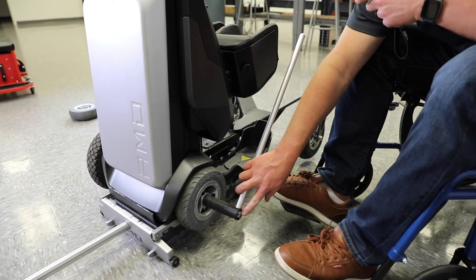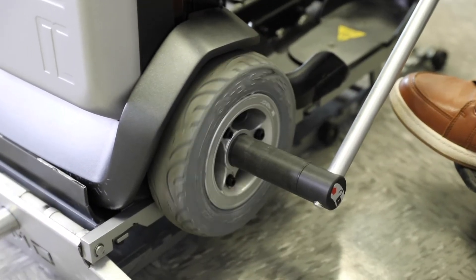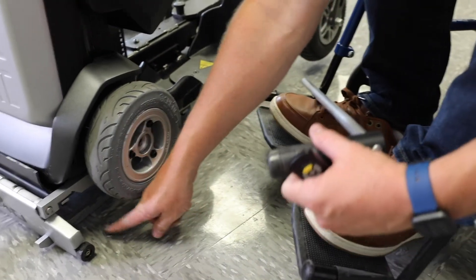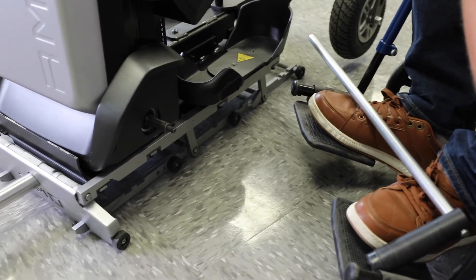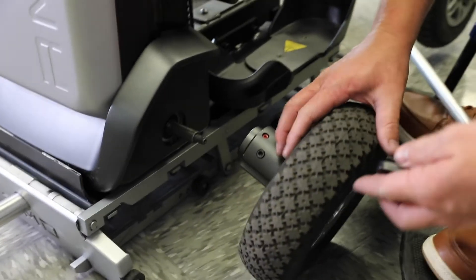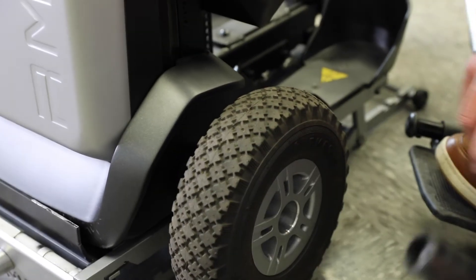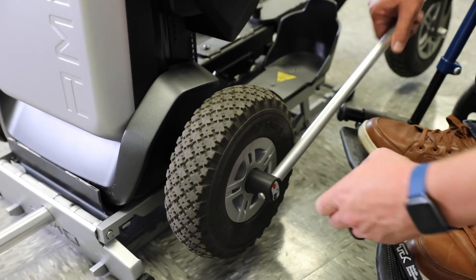Once I've got that on, I'm just going to turn it in the direction to loosen it — so that would be driving it in reverse. I'm just going to pull that bolt out. Now there may be some washers that come with it in the indoor kit — I'll just set that with the indoor tire to the side. Then I'm going to put the outdoor tire on, and again I'm going to line this dot up with that notch in there, and that'll slide right on. The nut is magnetized in there, so I'll put this on and then go the opposite way to tighten it back up.